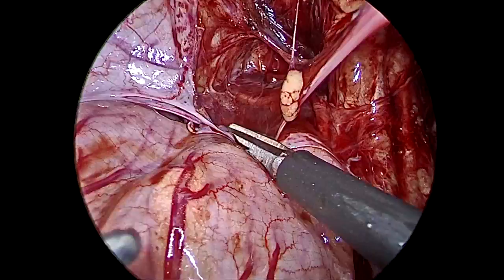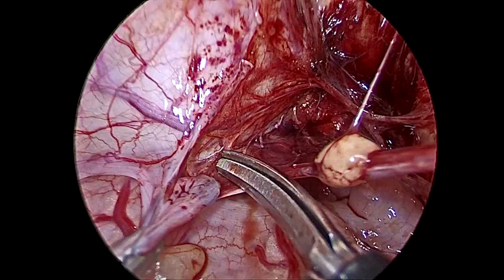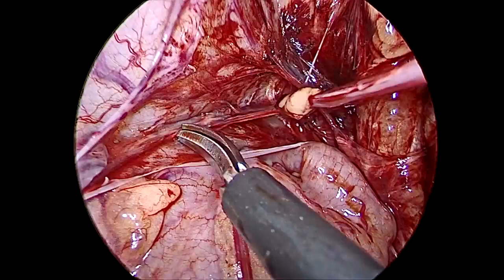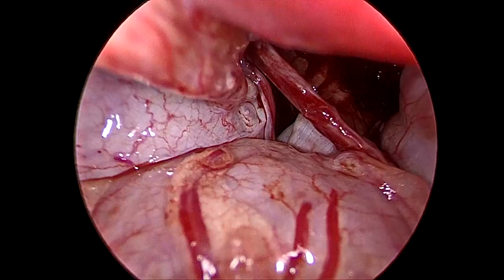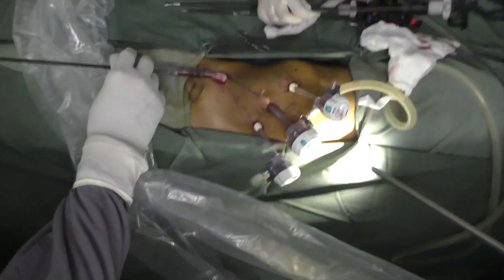We are pulling the testis from outside while the pneumoperitoneum is not removed. This is a peritoneal fold attached to the vas — nowhere have we gone close to the vas to compromise the blood supply. We are releasing so that it is going behind the bladder — more than enough. We cannot release more than enough and it is not useful either. Now we will bring out the testis after pneumoperitoneum is released. Don't pull too much. Now this much nice mobilization of the gonadal vein will not come in open surgery. The testis has come out easily by pulling — the port is removed.